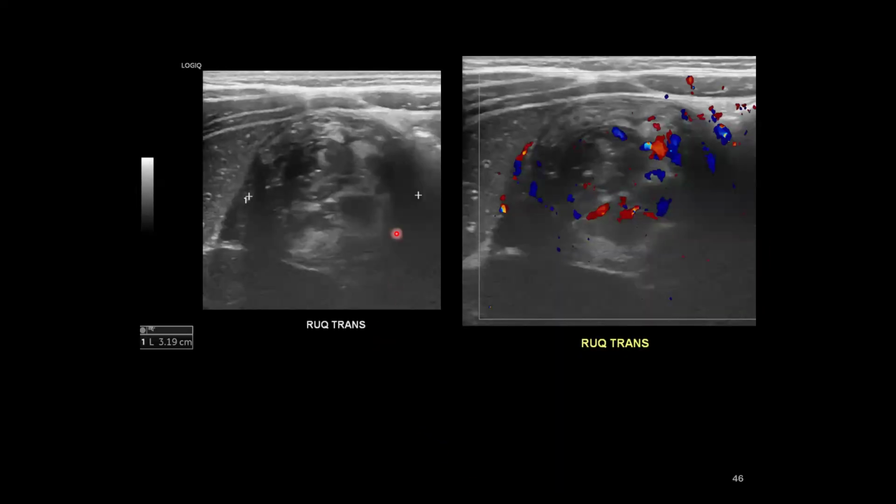And so here we are in the right upper quadrant. This outside layer of bowel is called the intussuscipiens. I think of it like recipient, so it's receiving the other part of the bowel. And then the inside part is called the intussusceptum, which is the part of the bowel that's telescoping into the other part. Typically, when we refer to intussusception, we think of ileocolic intussusceptions, so ones that go from the ileum into the colon, and they tend to be a little bit larger.